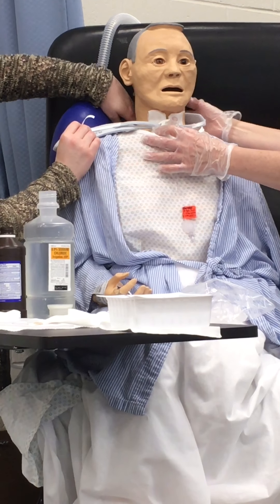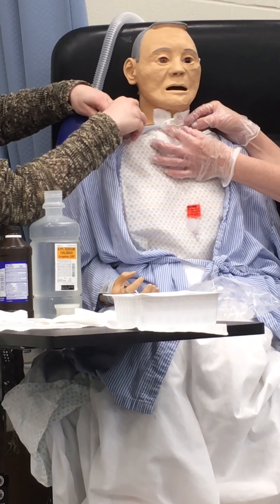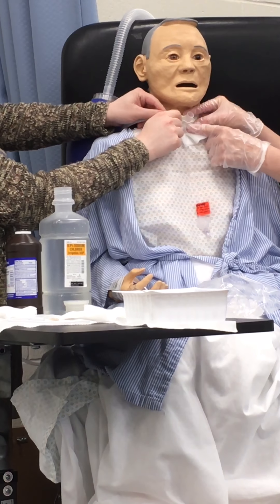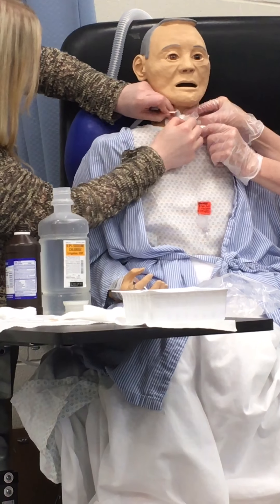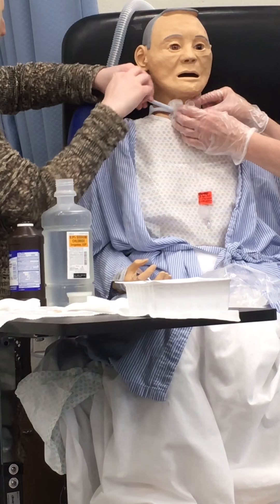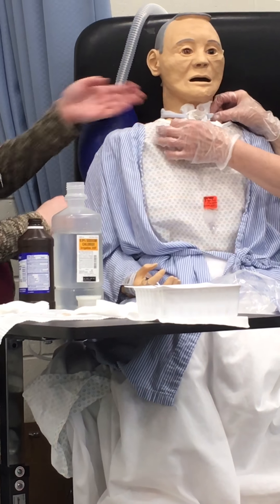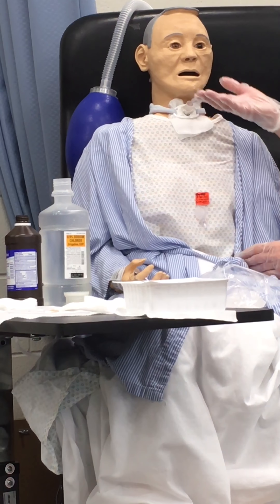Stephanie's right here holding you — smooth to my patient. These things bend, so bend just a little bit. The first person just going to attach it here, and Stephanie's side will do all the adjustment. I'm holding — I'm going to pass the old one to you, and here comes the new one. If I'm worried it's going to get caught in her hair, the best thing is just don't open the Velcro yet. Good communication between your partner. Now you can undo the old one. Gauze under it — you can bend this thing too. It's harder than you think because the Velcro is touching that gauze piece. Now you can adjust it — on my side I have one finger breadth. You can adjust it on yours: one finger breadth there, and then we just kind of straighten that.